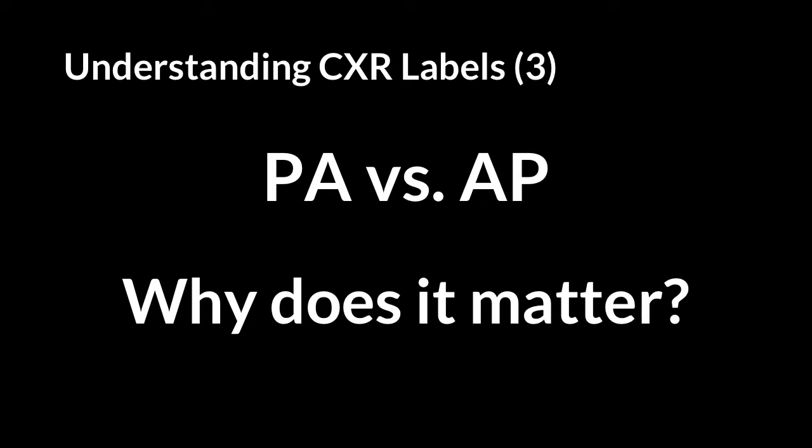The first L stands for lungs unilaterally — look at the right lung in isolation, then the left lung in isolation. Start at the right costophrenic angle and scan the right lung from bottom to top, then go to the left lung and scan down to the left costophrenic angle.